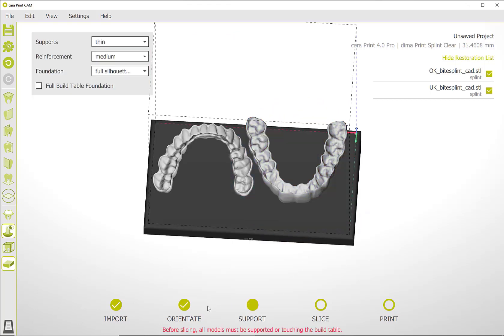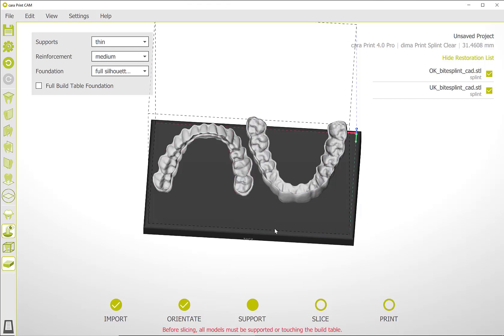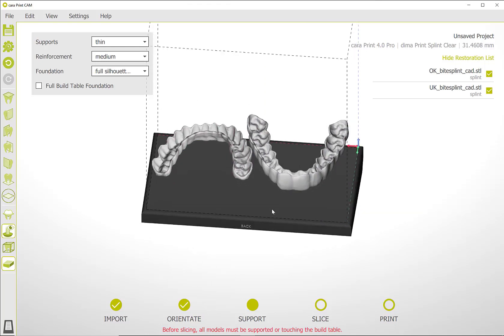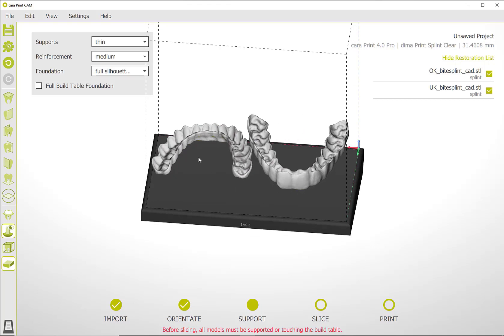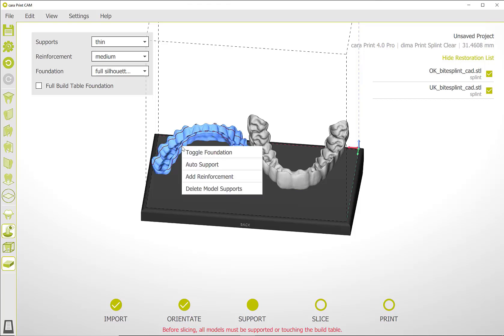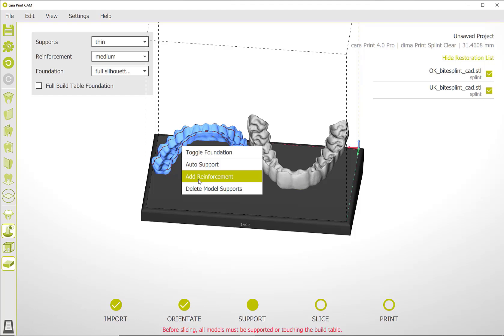In the next step, the support step, before generating automatic supports, you can add a reinforcement bar for more stability during printing up to light curing. To do this, go with the mouse over the object and open the submenu by clicking with the right mouse button. Now activate the add reinforcement function with the left mouse button.